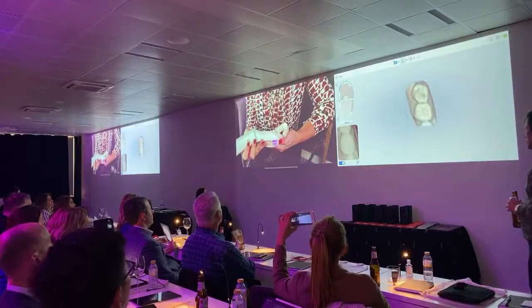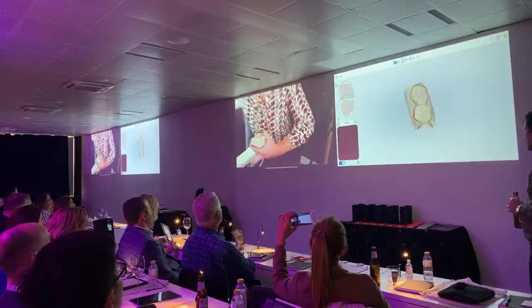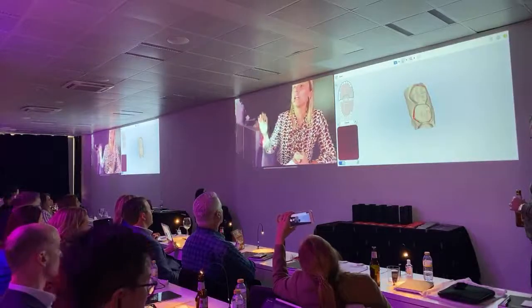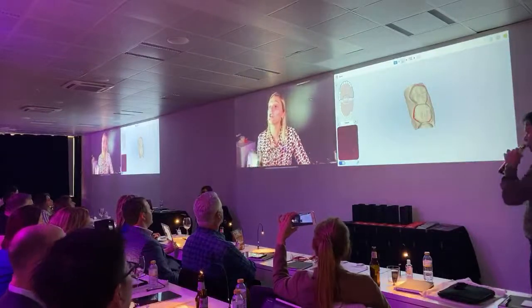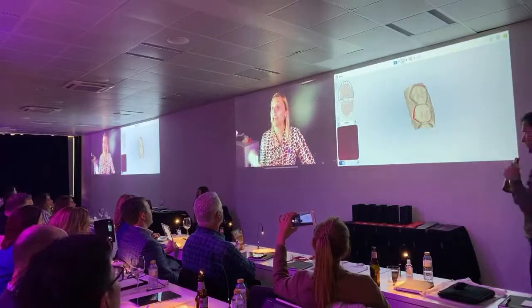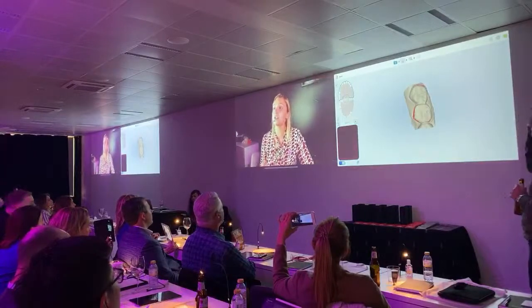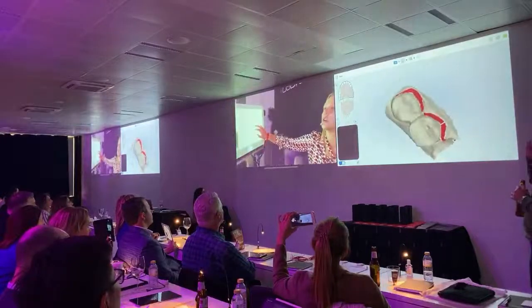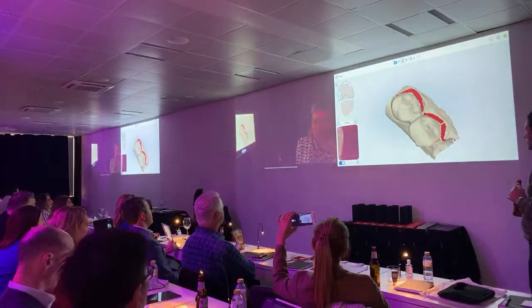area. One thing also, always stone model color. The teeth color is good in the first appointment in the hygiene sections because you want to show to the patient. Now is a technical scanning. You need to see the surface and see what you're popping. The color tooth doesn't show you everything, so always scan in this option.